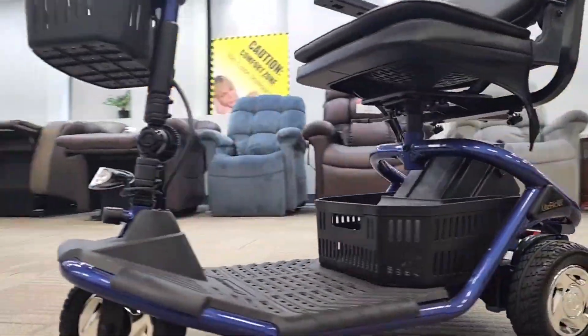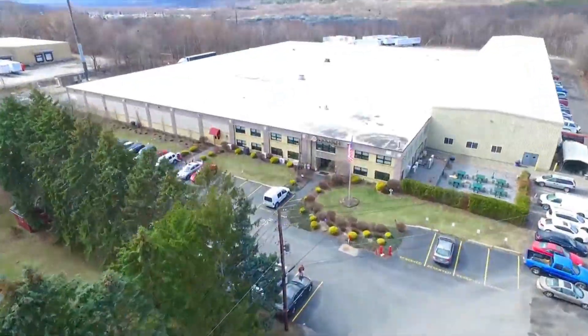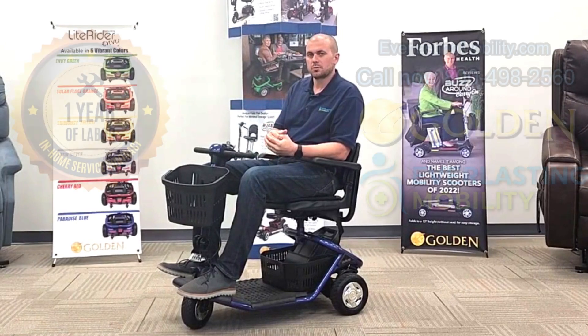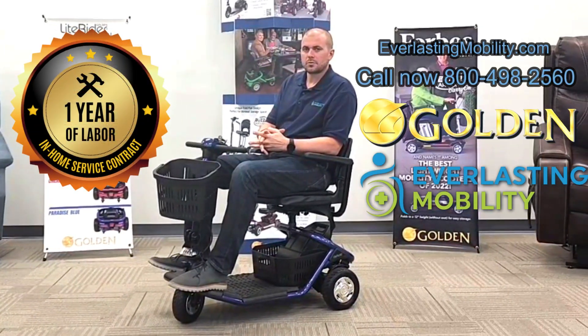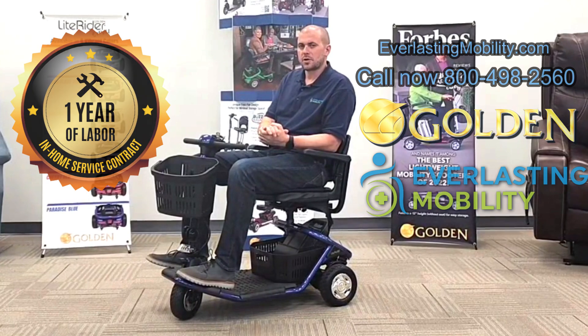If you're looking for a practical, affordable three-wheel scooter that is easy to break down into pieces, this is a great choice. It supports up to 300 pounds. It is made by Golden Technologies, one of the best brands in the mobility industry. They also have one of the best warranties in the industry, which includes one year of in-home service — as long as it's a warranty-approved claim, they will dispatch a technician to your home to diagnose and resolve the issue.